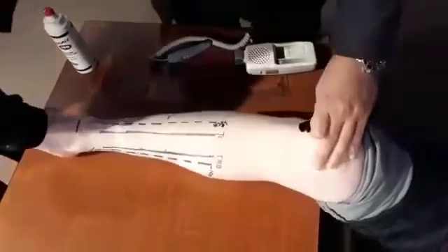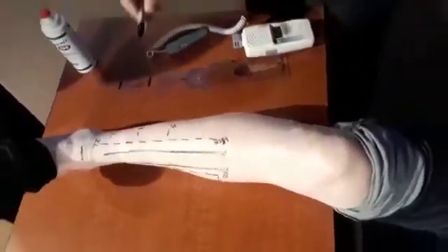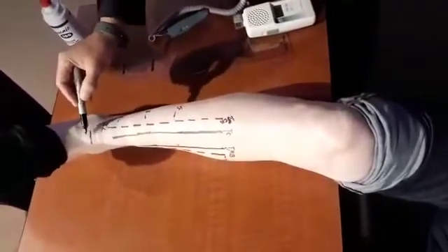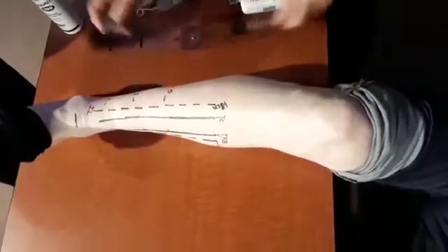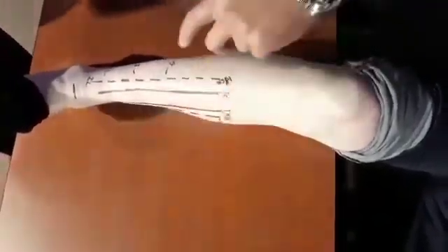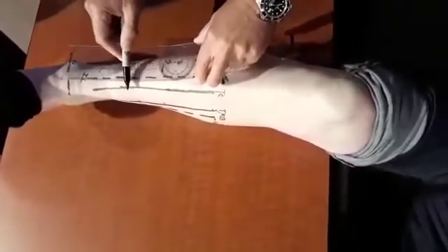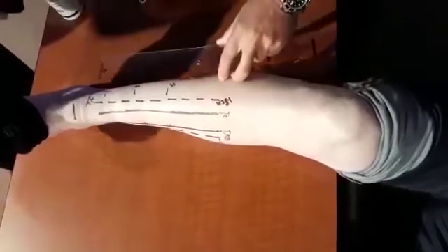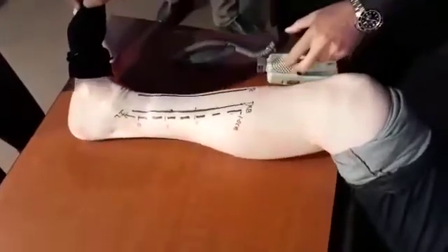If we stay on the lateral side, we mark from the ankle joint: 5, 10, and 15 centimeters — with the ruler, 5, 10, and 15. The same laterally and the same medially.